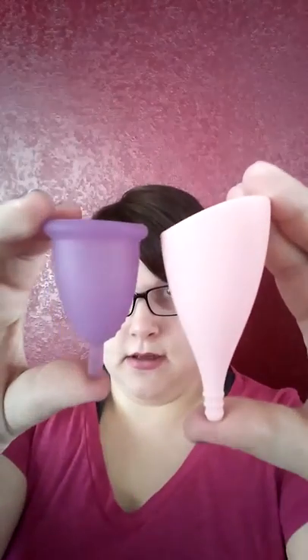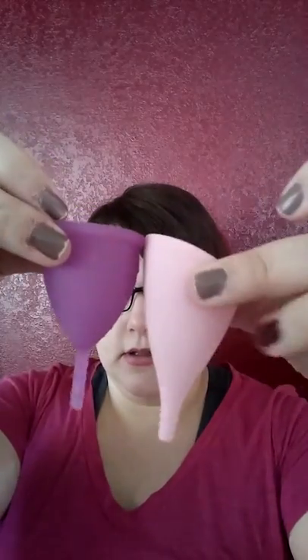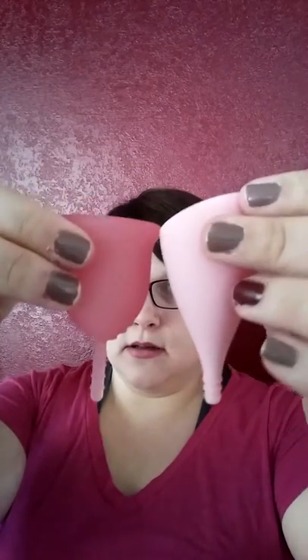Let's compare it to my other cups. Here it is next to the small classic MeLuna. Here's the model one Lunette — that's the shortest. Here's my Lena on the longest and on the shortest. And here's my Gaia cup.